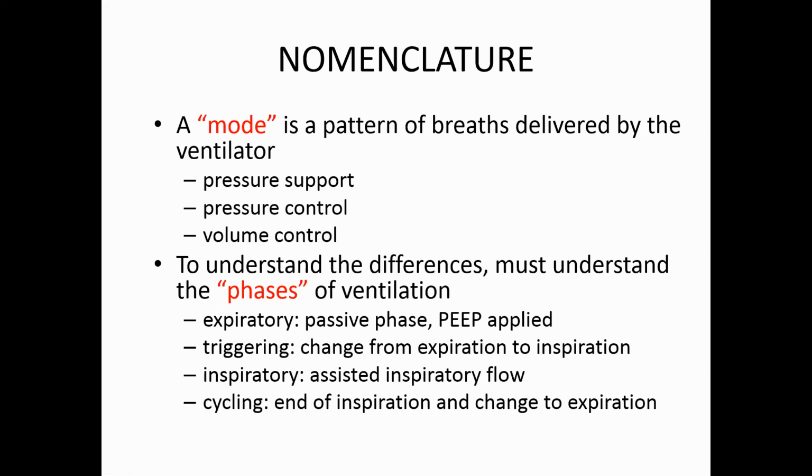It can be a pressure support, which means that after the patient initiates a certain flow, the ventilator will raise its pressure. Once that flow is decreased to a certain level, the ventilator stops. Pressure control, regardless of what the patient does, the ventilator is going to give a certain pressure. And volume control is when the volume is whatever volume you ask the ventilator to give, it will keep on giving it until it's done.